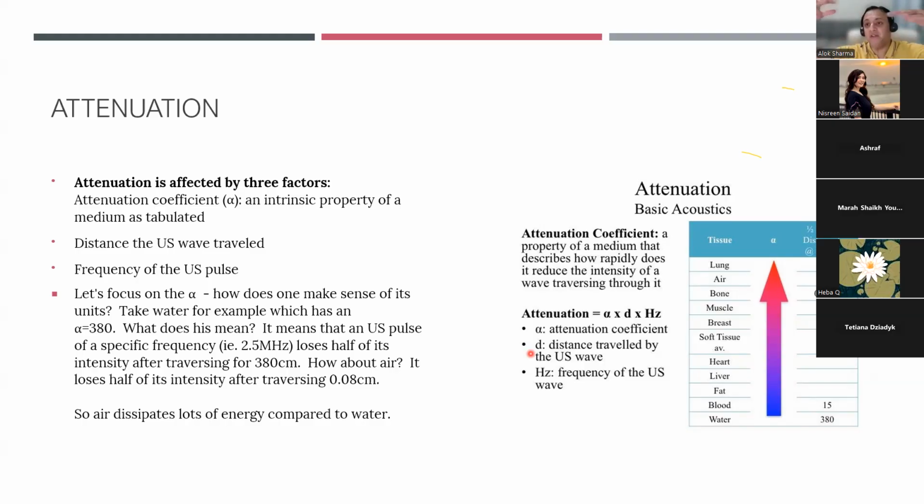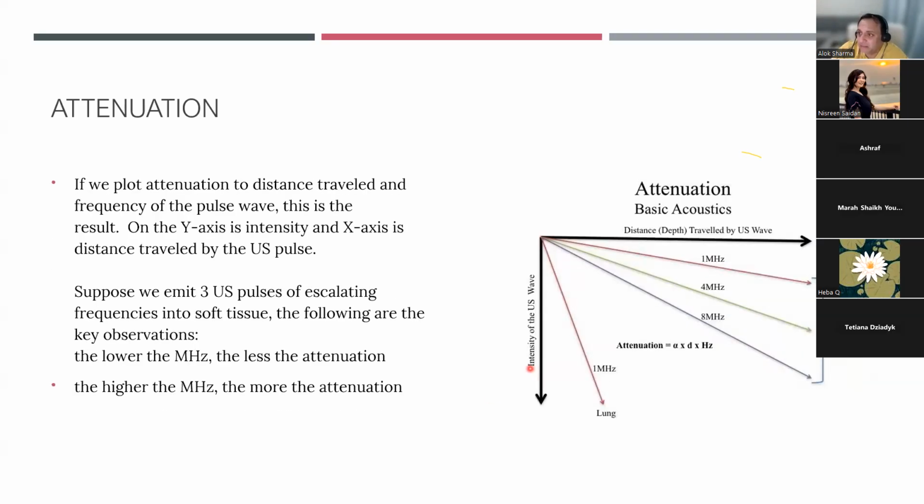But you can't see the areas of pleura under the ribs because the rib is causing 100% reflection. It's virtually absorbing any sound waves that go in and attenuating any that move behind it. So you can't see any pleura beneath it.